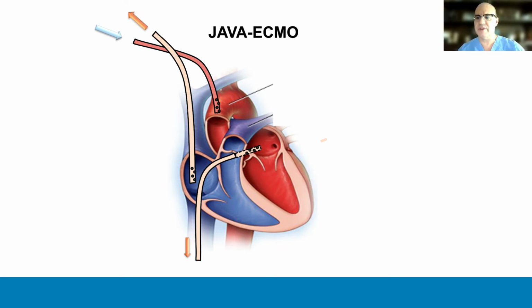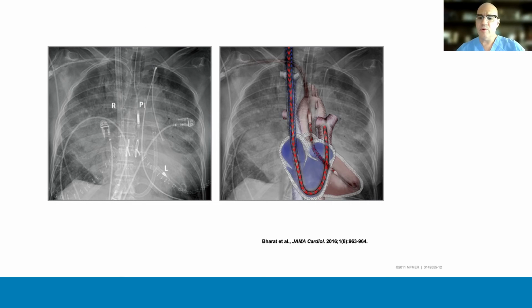So this is a configuration that we are going to more so, in conjunction with our interventional cardiology colleagues and electrophysiology colleagues. Or if you wanted to do a different configuration for LV venting that is readily obtained with an Impella device shown here, you could have a pulmonary artery catheter for outflow here, and then a femoral venous cannula for systemic outflow.